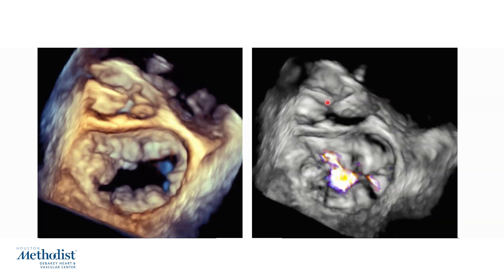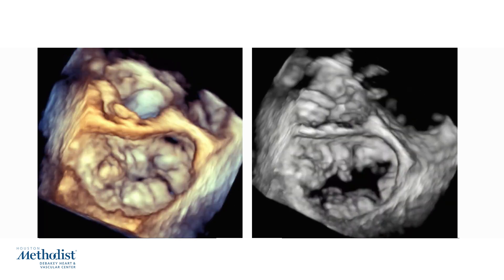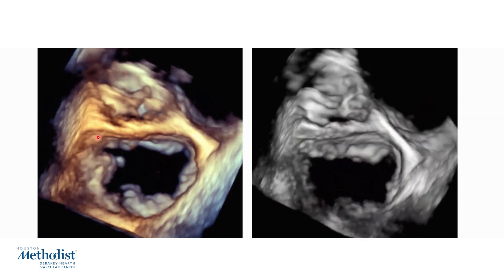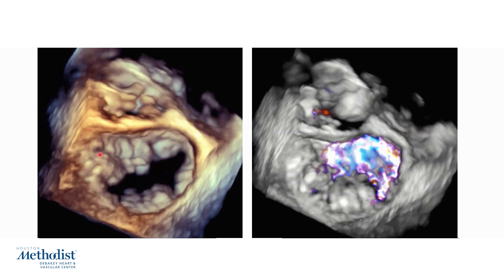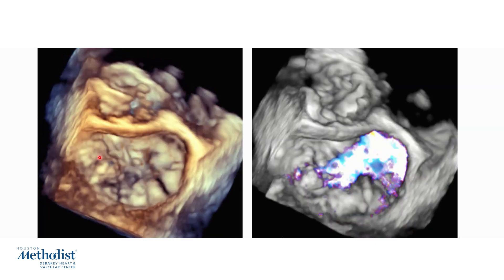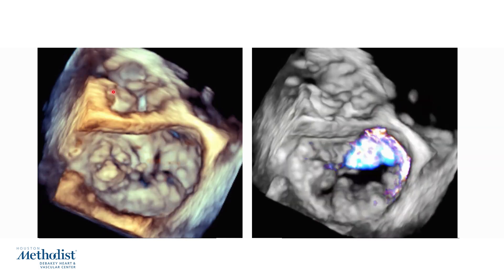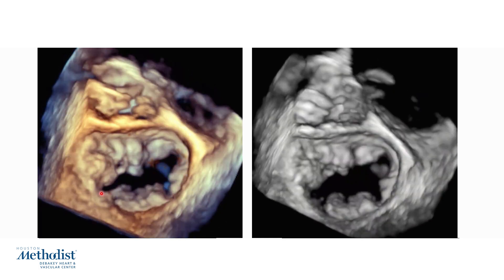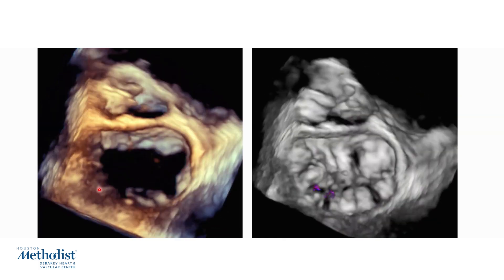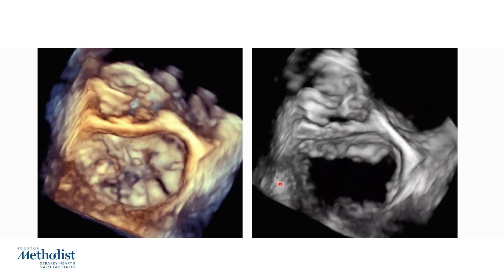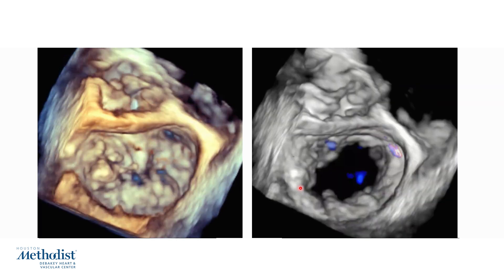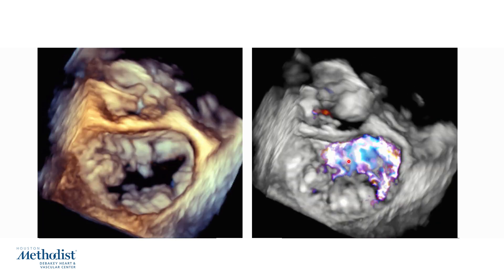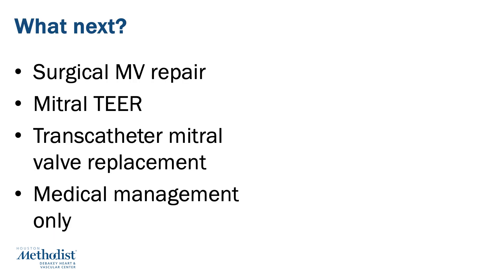Here are the corresponding 3D images with and without color. You can appreciate on this 3D en-face view that there are multiple prolapsing scallops in this mitral valve, and the flail segment is in the lateral aspect, which is the P1 scallop. The aortic valve is at 12 o'clock, with the anterior leaflet, posterior leaflet, and the interatrial septum visible. You can see the mitral regurgitation on the color 3D image originating underneath the P1 scallop, fanning from posterior to anterior and from the lateral to the medial aspect of the valve — extremely severe mitral regurgitation responsible for this patient's symptoms.